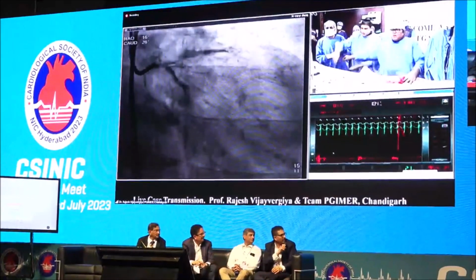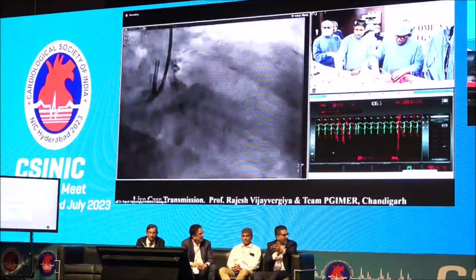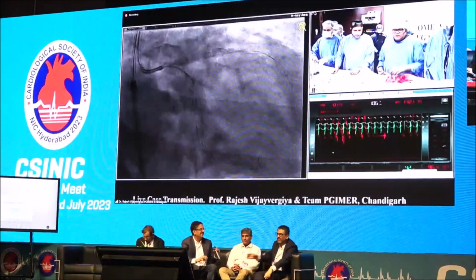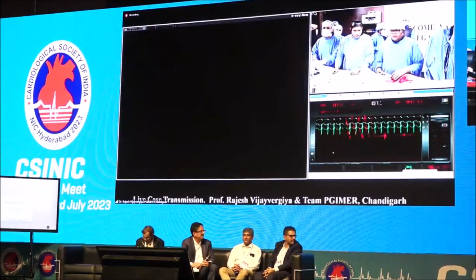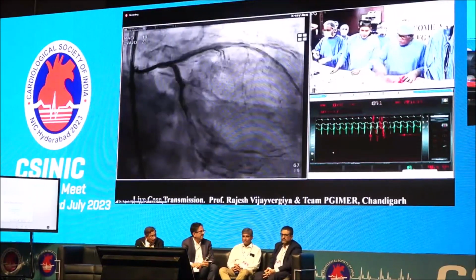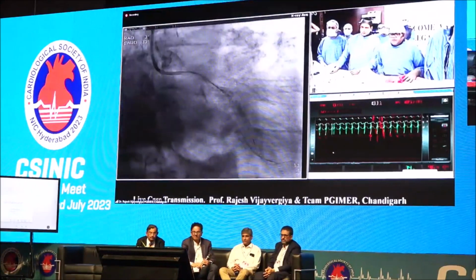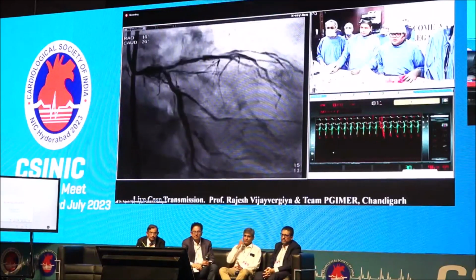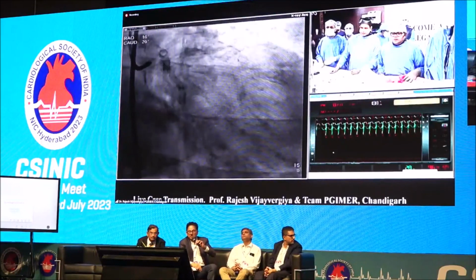Dr. Nirmal Kumar, what is your thought of the case? I think first we should do the good work for the circumflex ostium, if it is possible with a drug-coated balloon, and then do the stenting across the LMC, because LMC is also a critical lesion in one view. So you can go across the LMC to the circumflex.